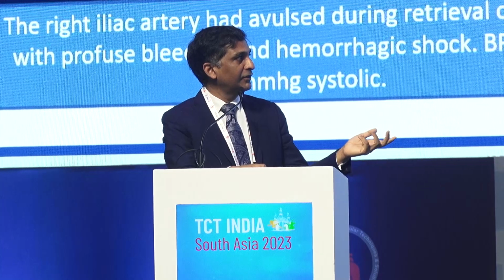So this is a patient after I was proctoring. I could not finish my sentence in time. I was telling the proctor to please make sure you remove the sheath very slowly, millimeter by millimeter. But before I completed my sentence, he pulled it out, and along with it came out the femoral and iliac artery. Luckily, there was a vascular surgeon who did this entire surgery over 2 months, and several skin grafts had to be done, but luckily the patient survived.